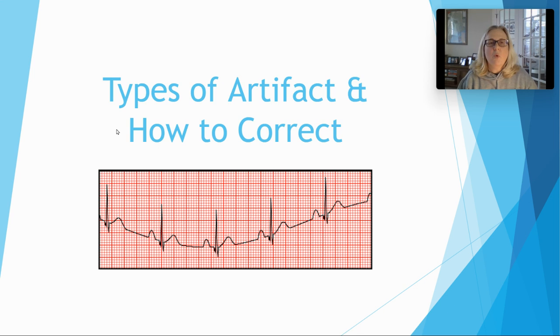So we want to know first, number one, what the artifact is called and why it's called that, and then how to correct it. You guys are going to be working on your EKGs with Miss Slama and or by yourself, so you need to know all the tips and tricks that you can use to fix them, okay? Because I'm not going to be there for a couple weeks.